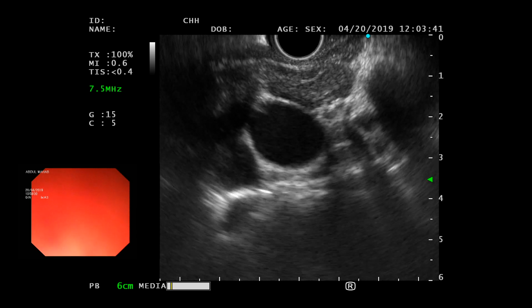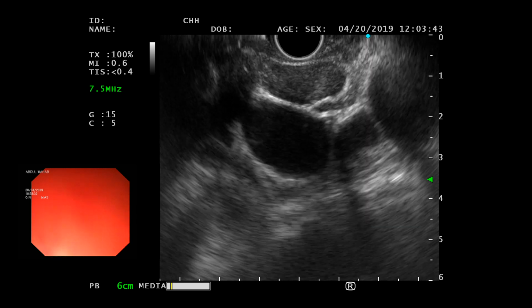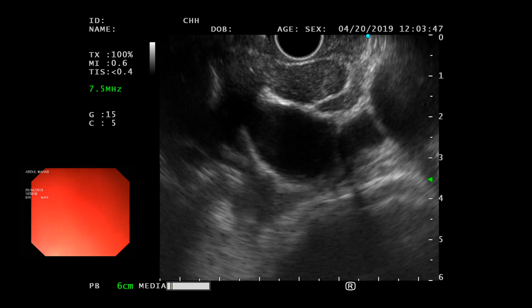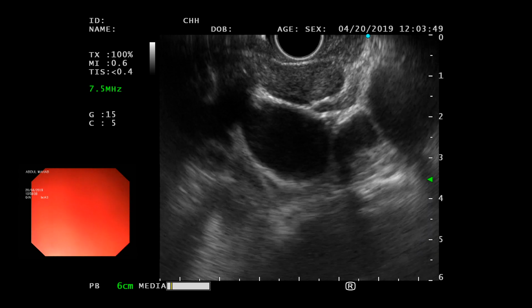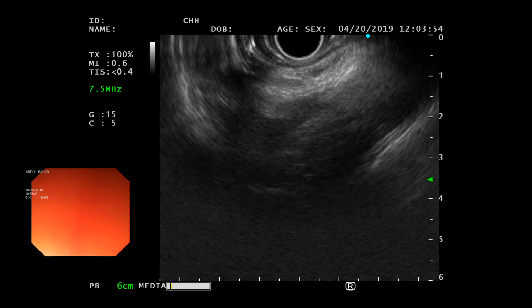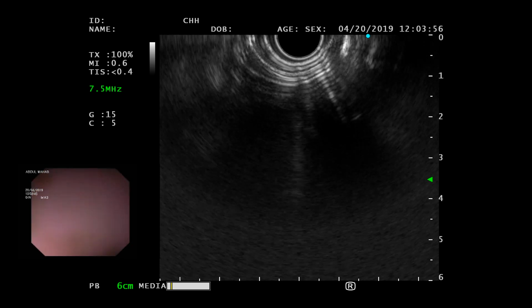Khalid, any comments? I think you have tissue on the previous one, right? We've got tissue before. And this is going to go into saline for GeneXpert. Okay, I think you should have enough on that too, so we are pretty much done. We are done. Yep.